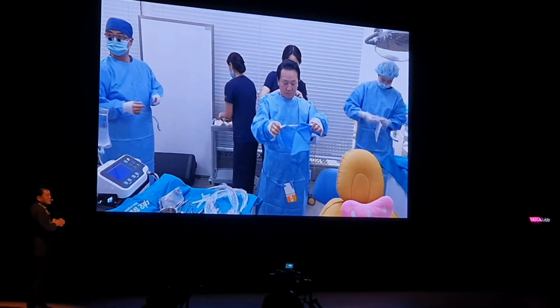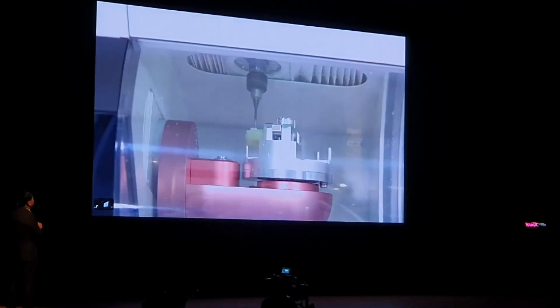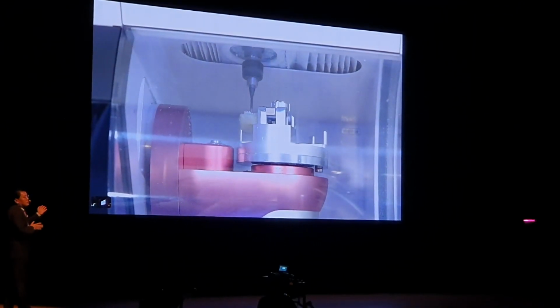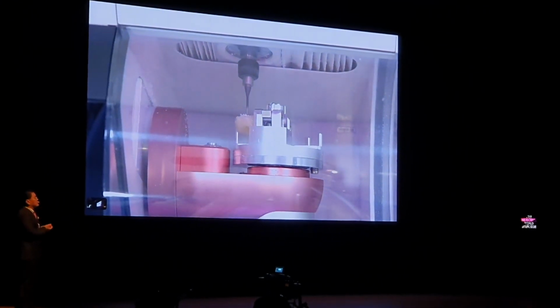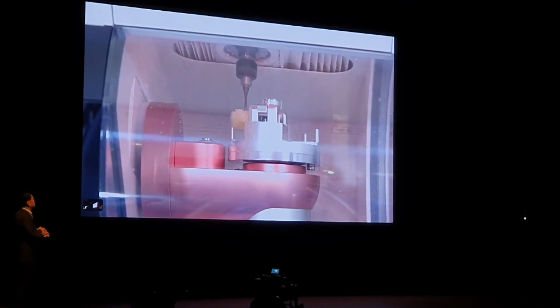So the patient is also wearing a surgical cap, surgeon's cap. It sounds like a milling machine is making a big noise, but it's because the camera is near the device. The sound isn't that loud in the clinic usually.